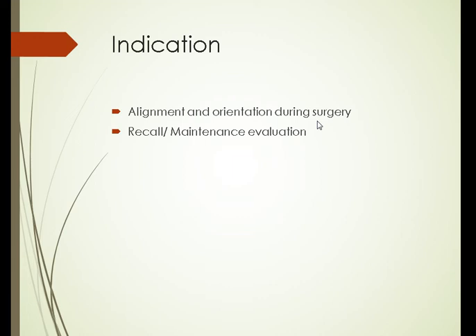Those are less affected by distortion, so you can have a really good idea with angulation when you're taking the PA if it's really angling away from the adjacent tooth or right down the middle. And also for recall, just to see how much bone loss at the crestal or if there's any radiolucency around the implant itself. So if you have a CT scan or not, and you have a PA, it still has a value of its own, and then our indication would be for those purposes.